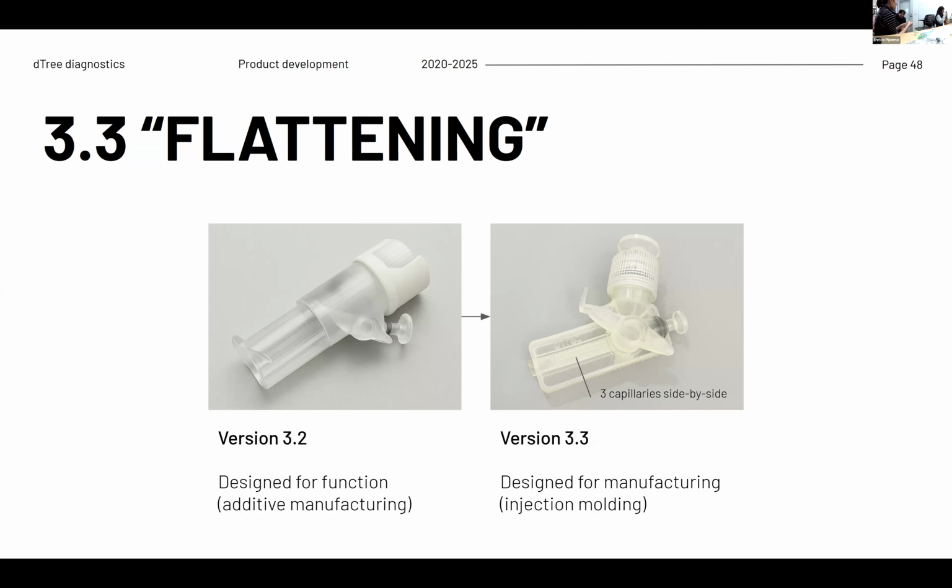The first thing before stress testing is obviously we have to make sure the materials are compatible. Then the stress testing is somewhat technical. You have to drop it from a level of 1 meter, and then you test whether it still holds up.